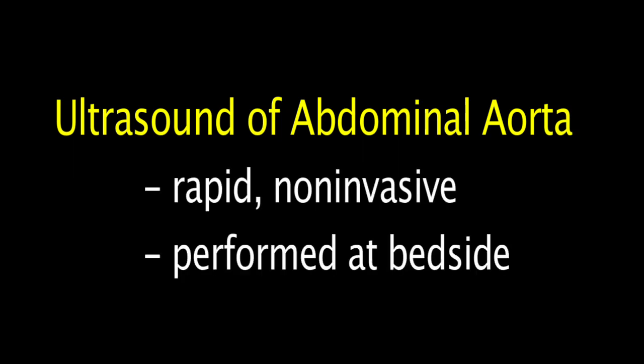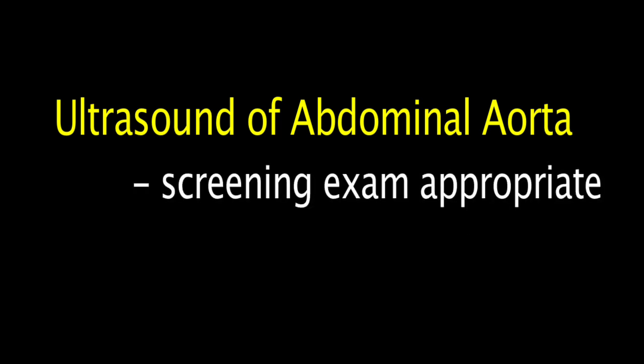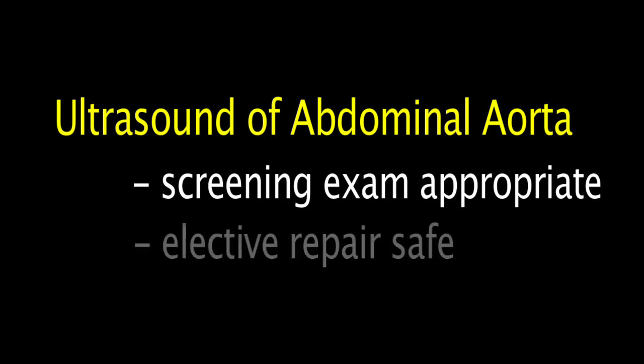Ultrasound of the abdominal aorta is rapid, non-invasive, and can be performed at the patient's bedside. The dramatic benefit of ultrasound in the emergency department has been well studied and has a sensitivity of nearly 100%. Ultrasound screening exams for asymptomatic high-risk patients are also appropriate. Elective repair is relatively safe.